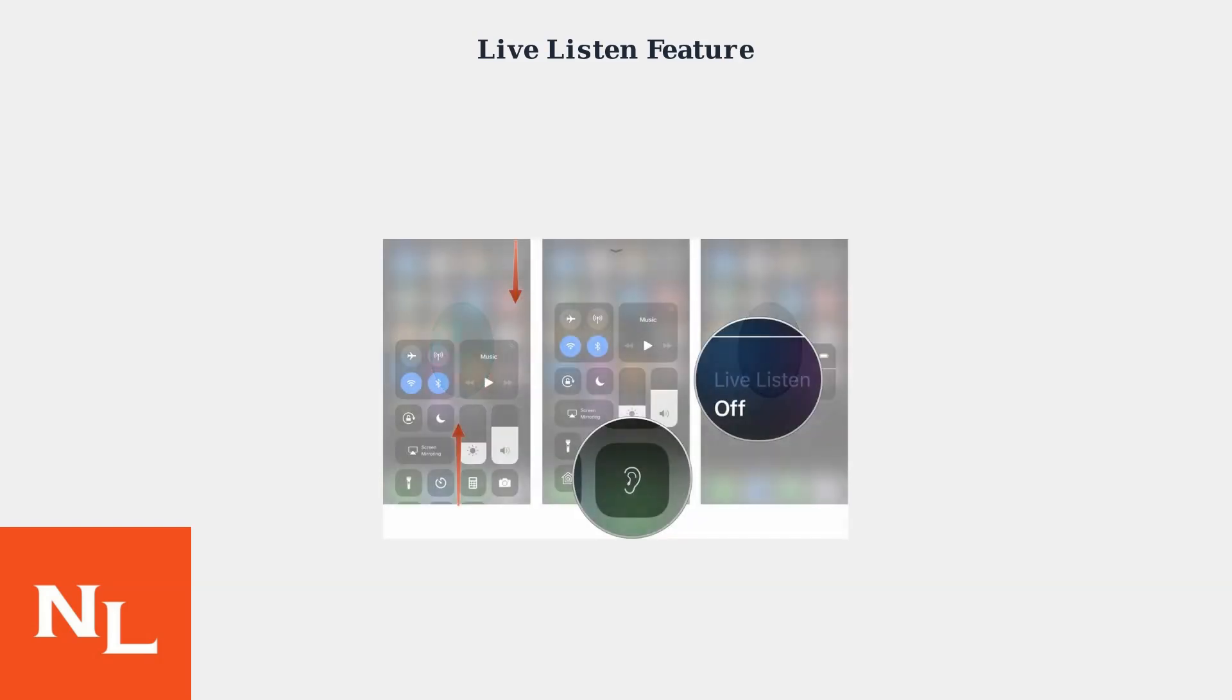Live Listen turns your iPhone into a remote microphone, streaming audio directly to your AirPods Pro 3. To enable it, open Control Center by swiping down from the top-right corner of your screen. Tap the ear icon, then toggle Live Listen on. Keep the iPhone near the sound source for best results.